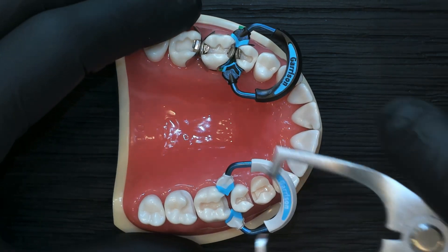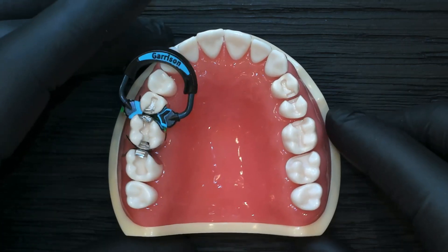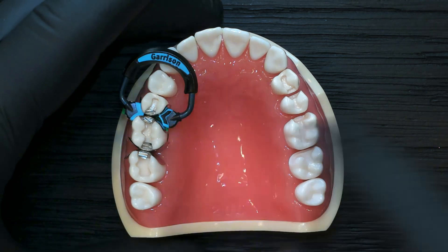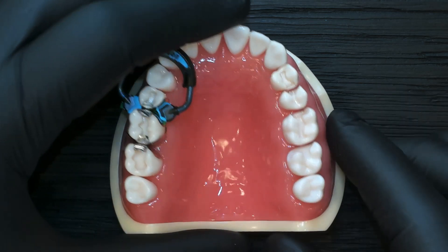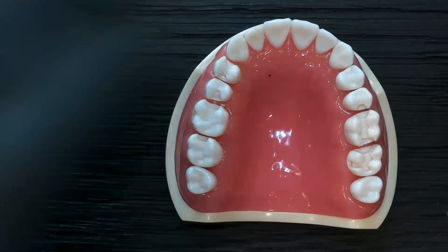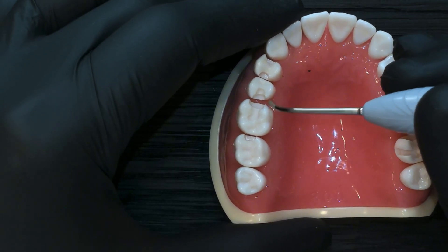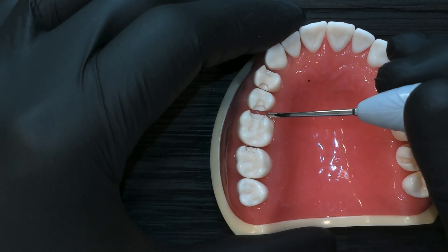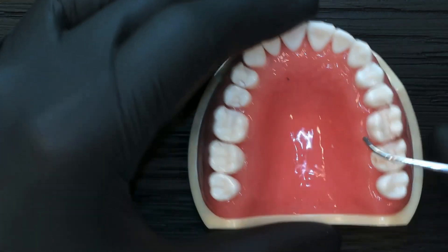An important factor is case selection. When doing back-to-backs, it's important to understand which situations allow the driver tip and quad wedge to engage and give you the separation needed for two matrix bands. When lesions are sized like this, we have enough tooth in these areas to allow the ring to really engage both embrasure spaces and create maximum separation.